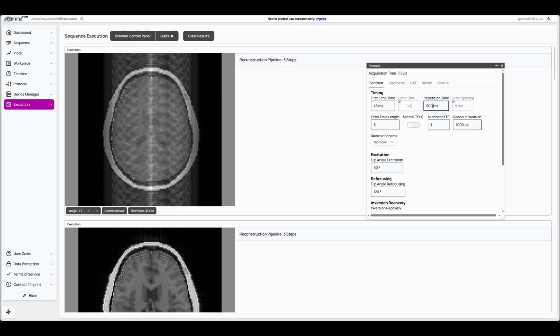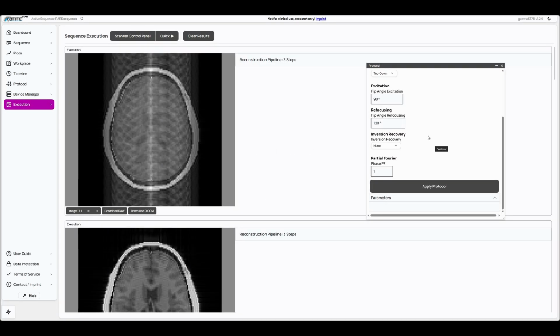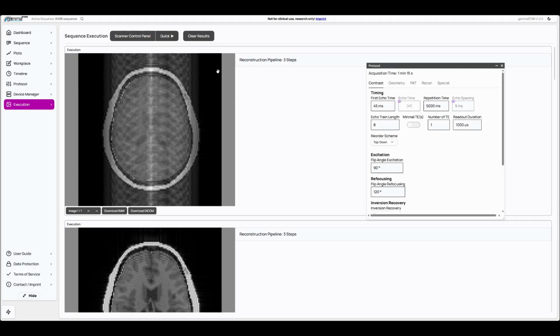So for a T2 weighting, we need to make sure that the T1 values of our tissues do not have any influence on the generated transversal magnetization. That means we want to make sure that all T1 components basically fully relaxed. So we need to make the repetition time long, which is what we would want to do to get rid of these ghosting artifacts nonetheless.